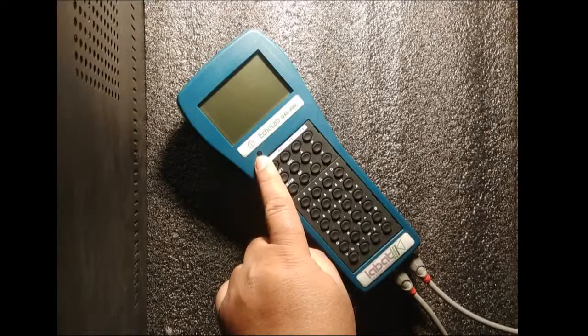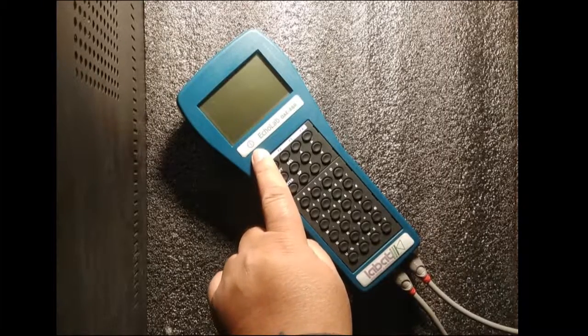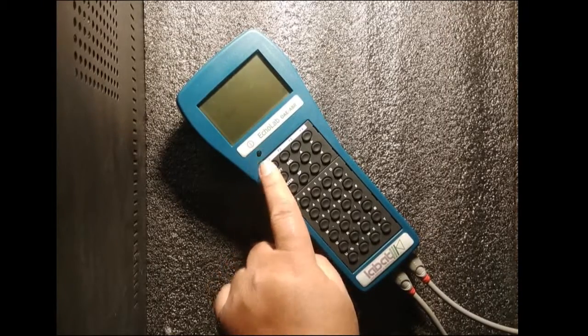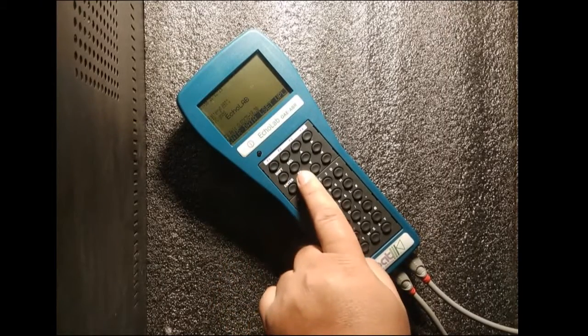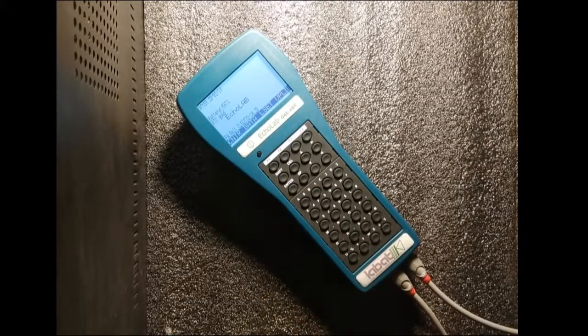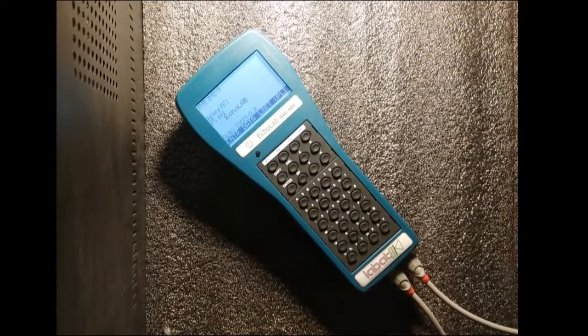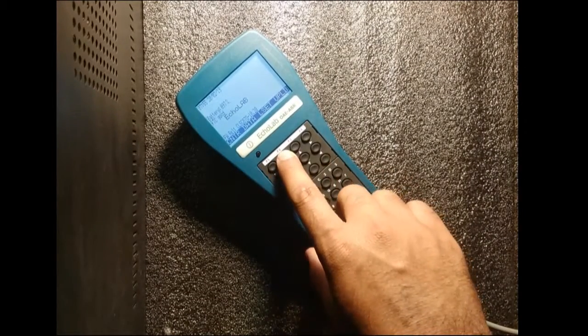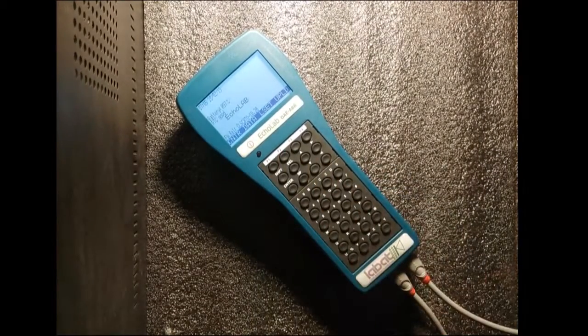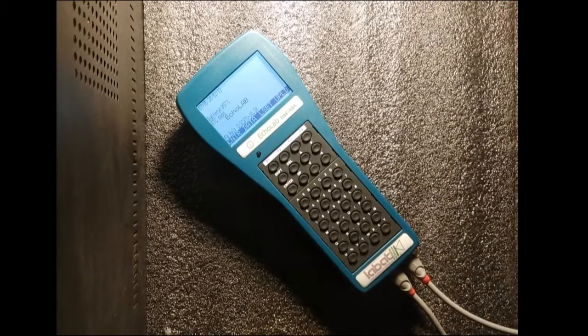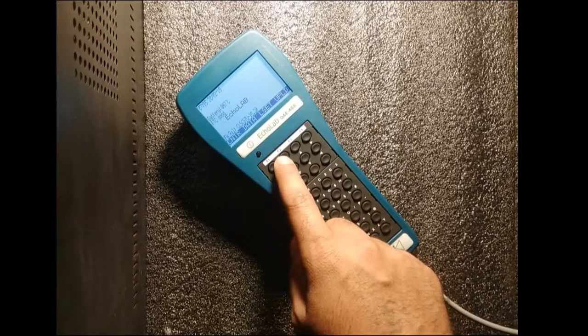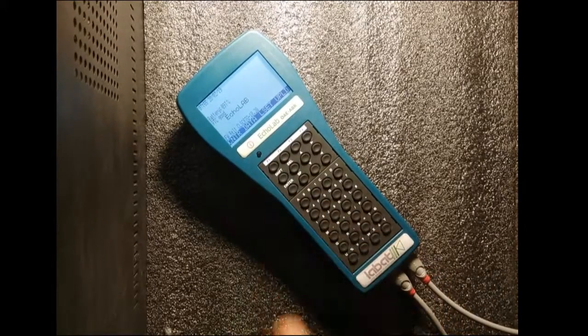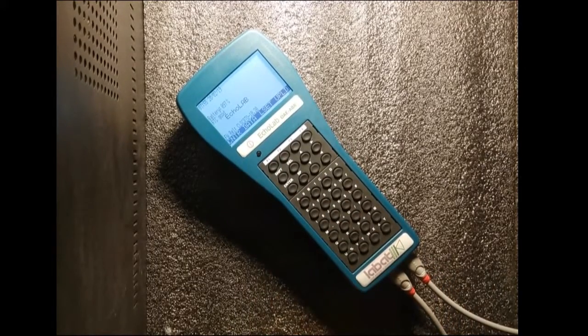Let's start the test. We are turning on the equipment and now we are turning the light on the display. Now to do the test, we have to press F2 and we will go into the test menu.